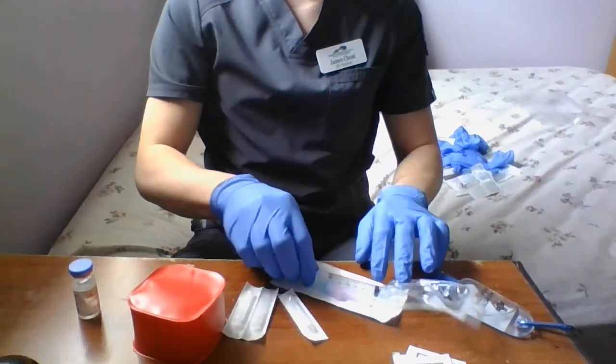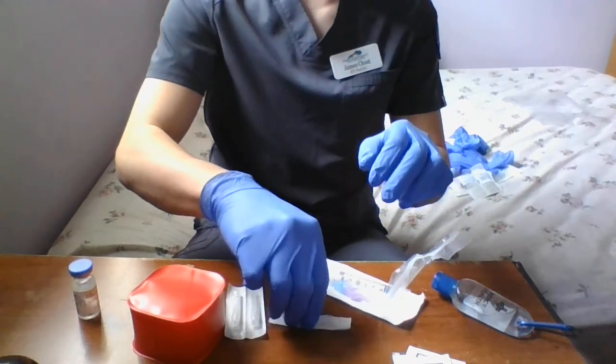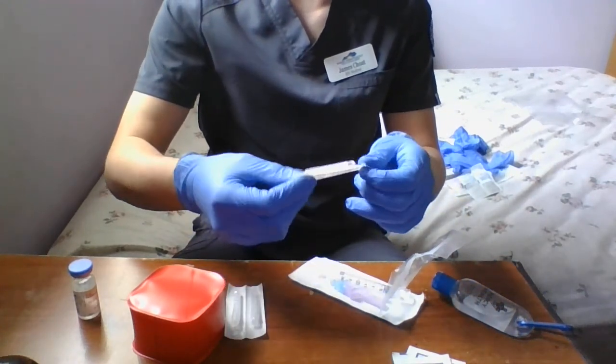But I'm going to knock on the client's door, introduce myself, identify the client using two identifiers, which is name and date of birth. I'm going to explain that we'll just be giving an intramuscular injection today, which is the 1.5 ml of Demerol. So I'm going to begin by opening it up. I'm going to tilt it down just so you guys can sort of see. Got the plunger. I'm going to open the cannula.